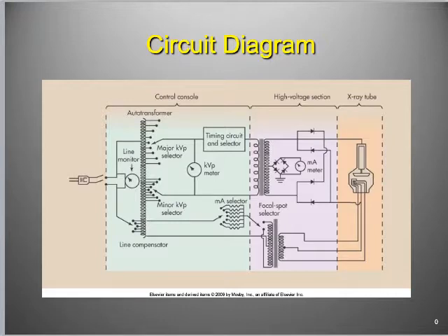So that's why we pass it through rectification. We'll talk more about it in a second, but we're going to alter the waveform now. We're going to get kind of weird with waves and stuff. Change the waveform.